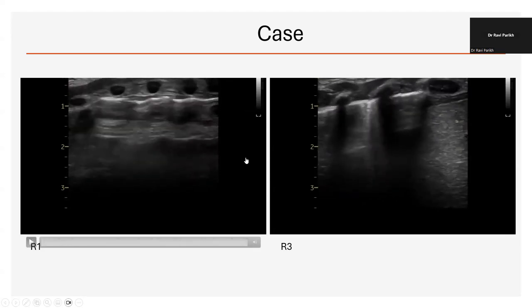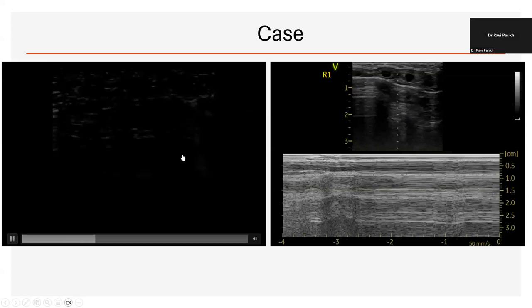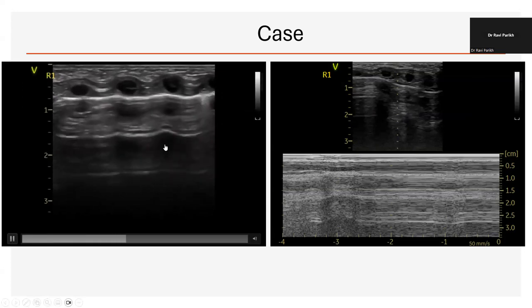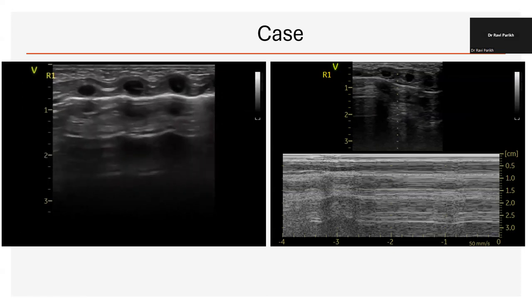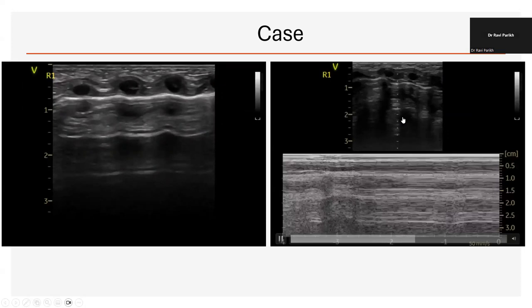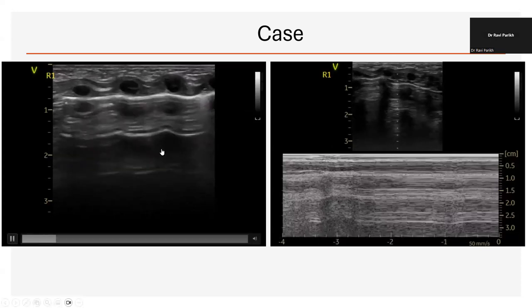So this is just a comparison side by side again. And this is R1 for you. Okay, but slightly lower down. So it's in the middle as opposed to being, it's actually R1, R2. So anything? The M mode is sandy beach side. It's not typical barcodes. I'm making this up. Okay. There seems to be a transition between the seashore and the barcode, isn't it, Alok? Yeah. Very good. So beautiful. Both of you have done fantastic.